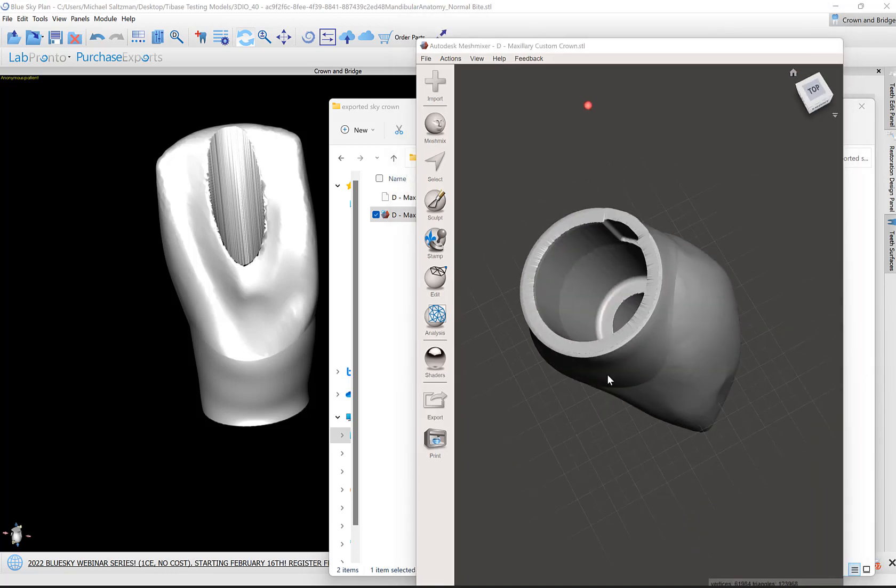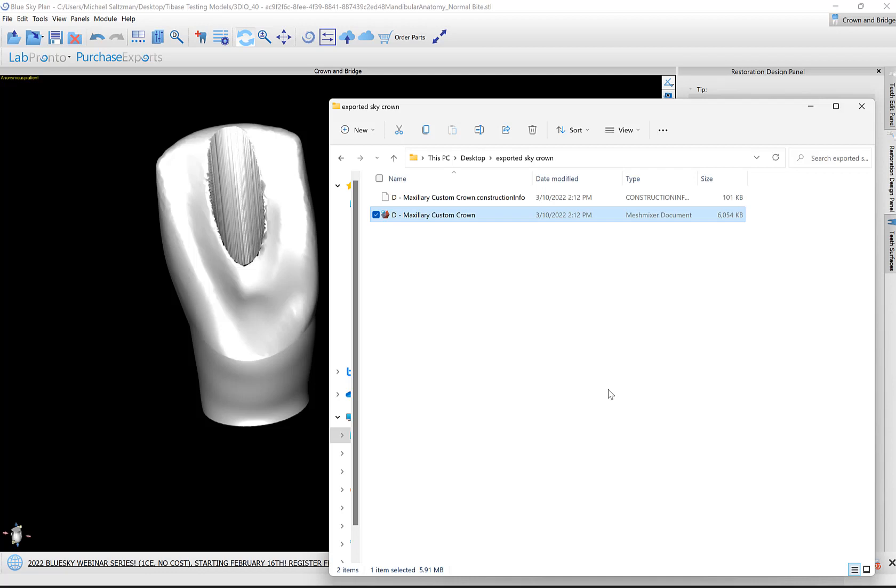This video took a bit longer than expected as I was explaining step by step. When you make your first crown or two, it will take some playing with, getting used to the process flow and the software. After you do it once or twice, you'll be designing your crowns in no time.